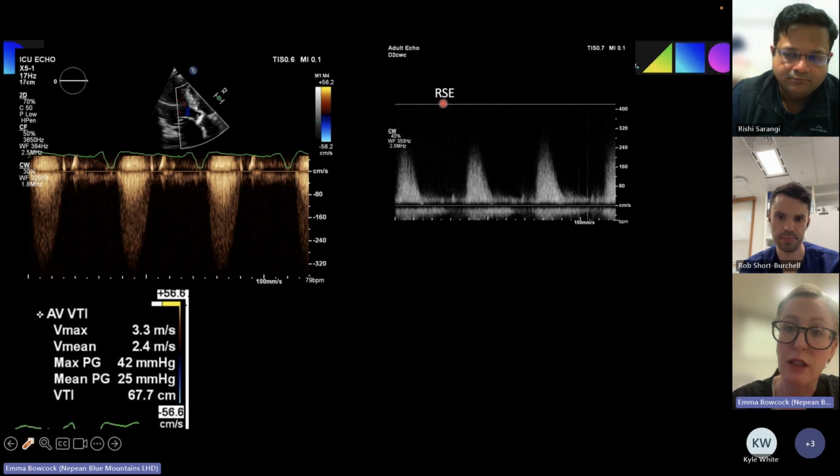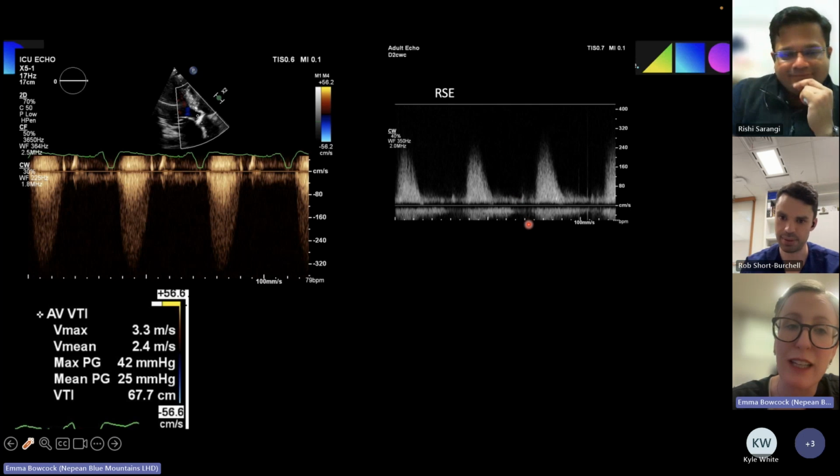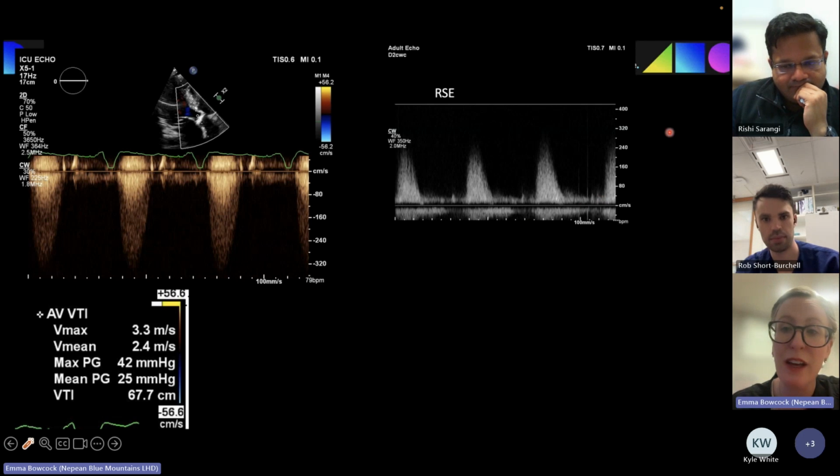We also try to do this. I think this is my attempt actually at the right sternal edge. Look how terrible it is. What probe have I used here for this one? PDOF, yeah. So sometimes in the DDU Viva for an aortic stenosis Viva case, they might show you this picture, and you'd need to recognise that this was flow coming above the baseline.